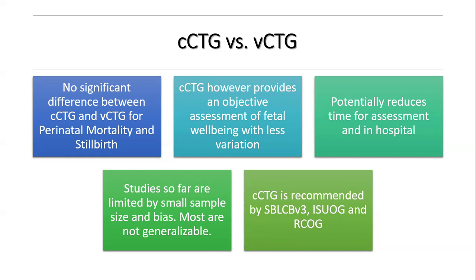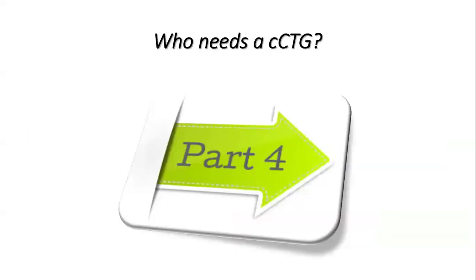So having the computerized CTG becomes the most experienced person to look at the trace again if it says the criteria has not been met, and potentially also reduces the time because you are not waiting for a long time once criteria is met, and criteria can be met as quickly as 10 minutes. So it's an objective tool that can be used.